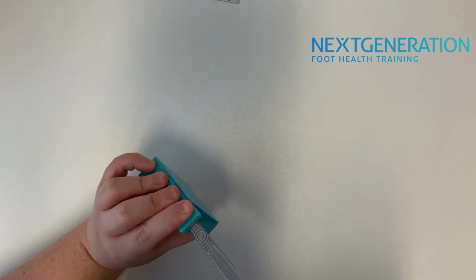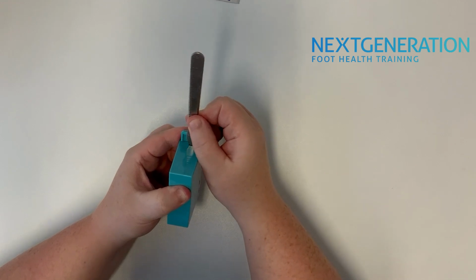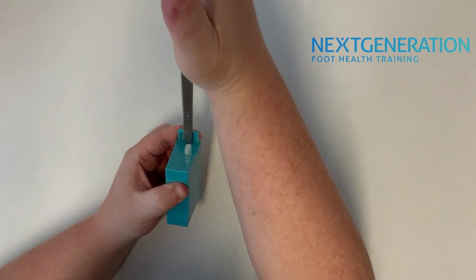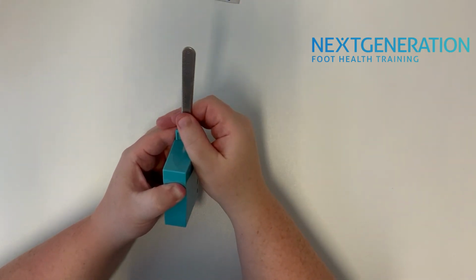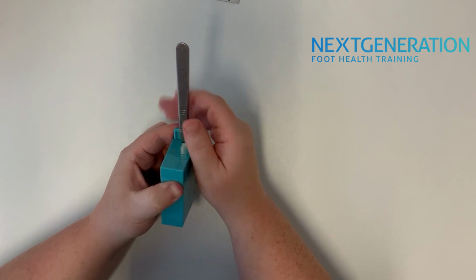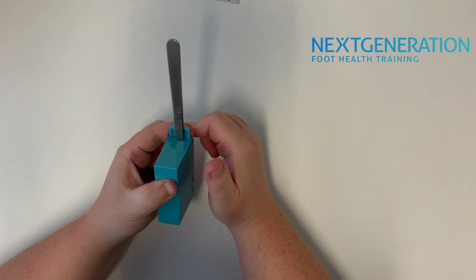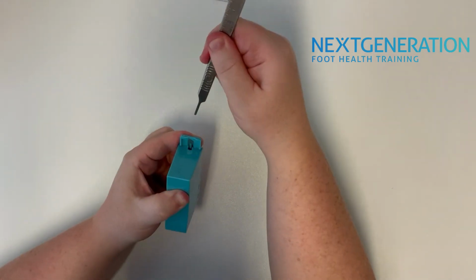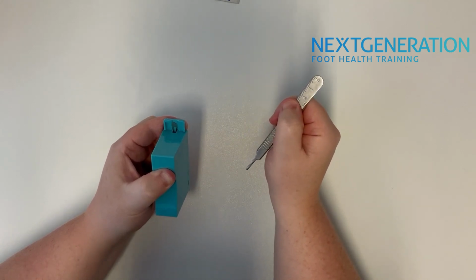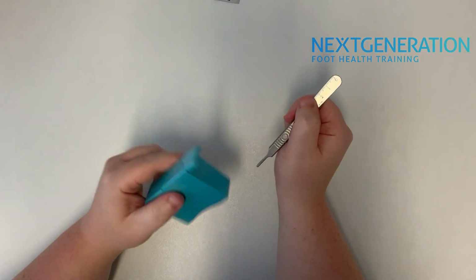And with my other fingers, I'm just putting some pressure on the box. Now that handle piece, it can wiggle, but I don't want to really wiggle it whatsoever. But basically it's going in that direction, that handle piece, if I was to pull it straight. So I don't want to wiggle it, I don't want to twist it or anything like that. I literally just want to pull it in that direction. And if I put some pressure on the end and I give it a pull, the blade comes off. I've got the pressure still on the end of that box, but if I release it now, I can just shake it into the box. So I'll show that one more time.